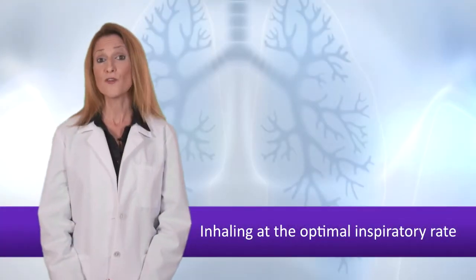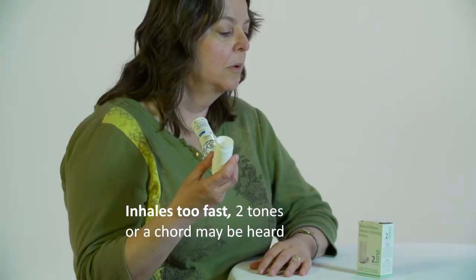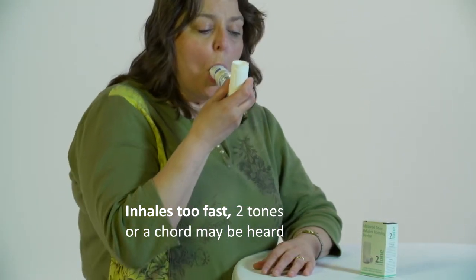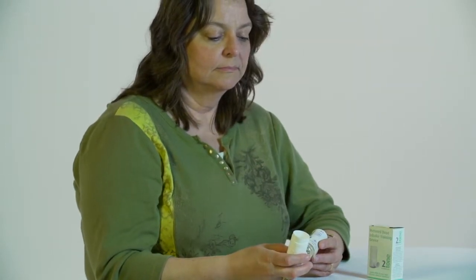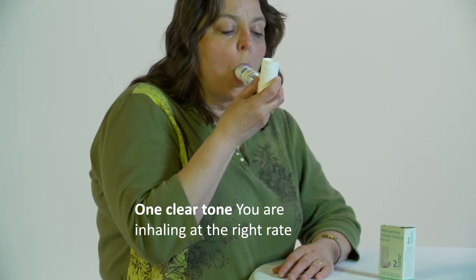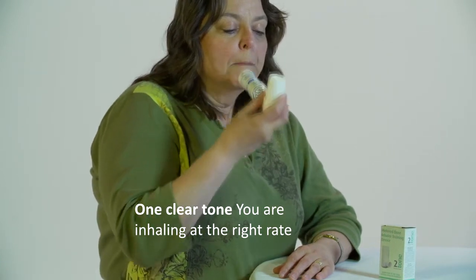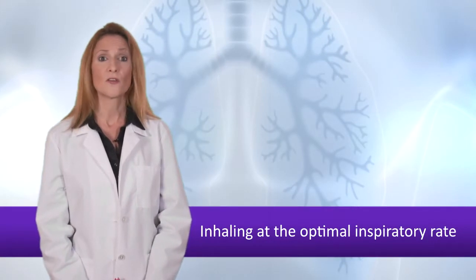Secondly, if one inhales too fast, 2 tones or a chord may be heard. That sounds like this. Lastly, if one clear tone is heard like this, you are inhaling at the right rate. With repeated practice, a patient can learn the right rate.